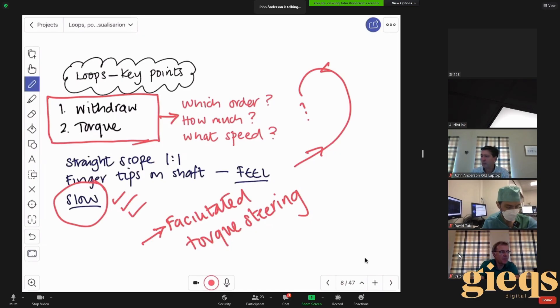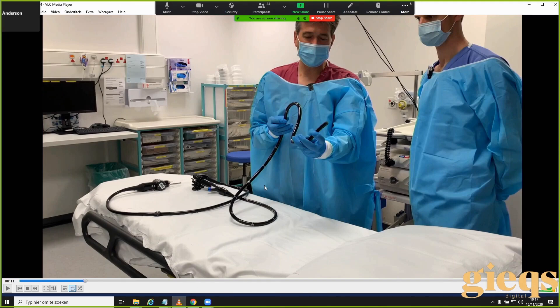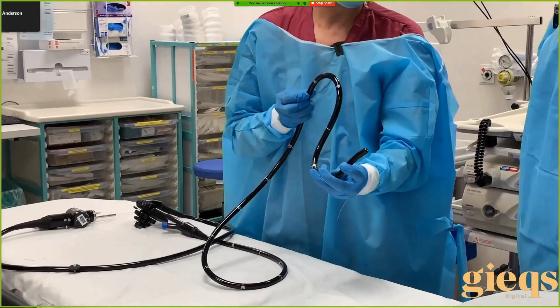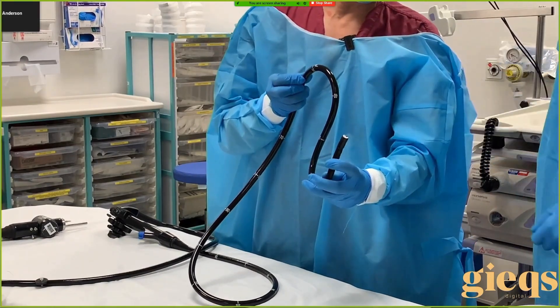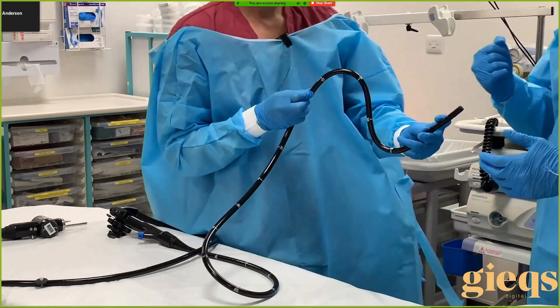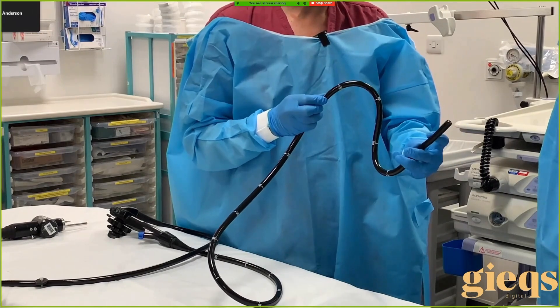Now we're moving to the final two videos — firstly dealing with very tight N loops, which is slightly different, and secondly briefly showing how you move loops into the umbilicus. Everyone watching will recognize this: if you pull back you come out, if you push in the patient gets a lot of pain. How do you resolve that? If I pull back I come back, if I push in it gets worse and the angle gets worse. Do you change the tip? Still happens. Do you pull out and down?